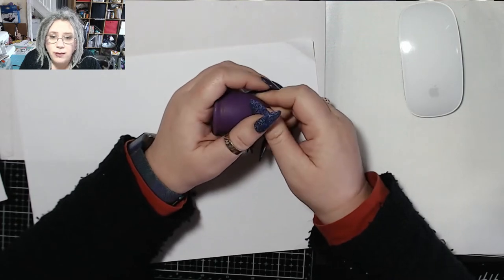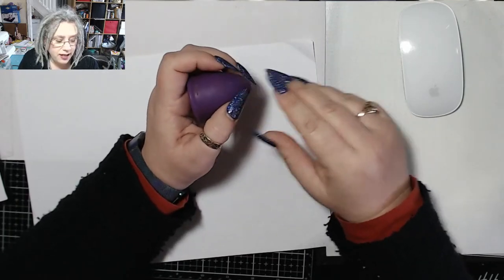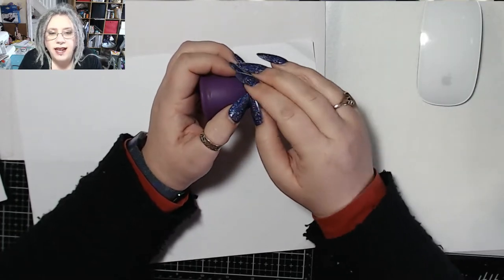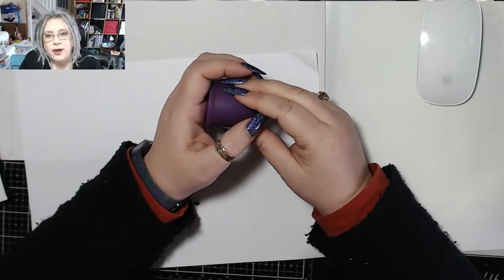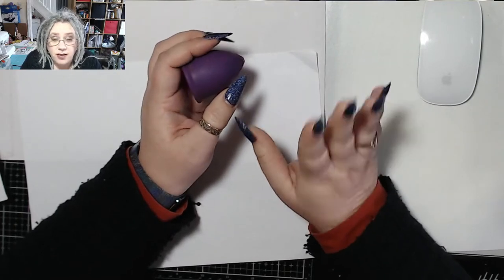I've heard lots of questions about how do you manage with nails that long — that's something I'm going to show you. Another question that came up today was somebody posting in a cup group on Facebook asking how do you all manage to get several fingers up there to get hold of it? I don't — I use one finger, it's my fourth finger and that's it. So that's something else I'm going to show you.